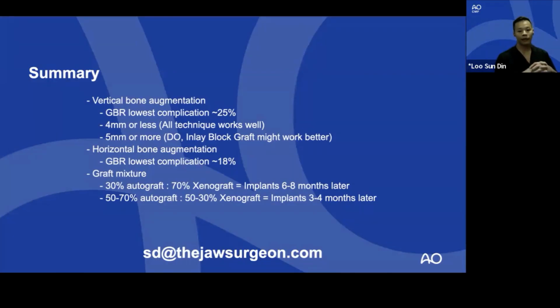In terms of other supplementary surgical procedures like connective tissue graft, sometimes I'll do it, but typically, if I need contouring after bone graft, I'll use stuff like Ossix Volumax or BioGuide Compress, just to bulk up the region, because we don't really need that much more than an implant. And if adequate bone is present and we just want to contour it, we can use whatever means we have.